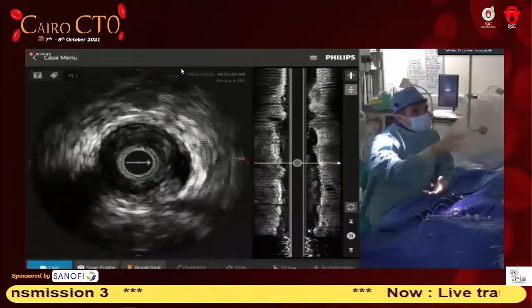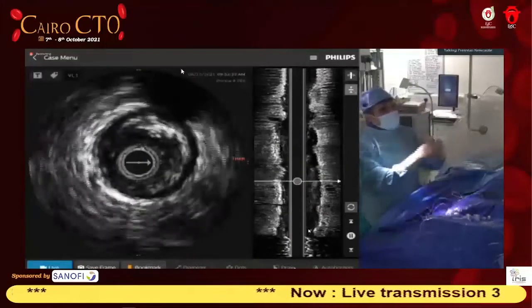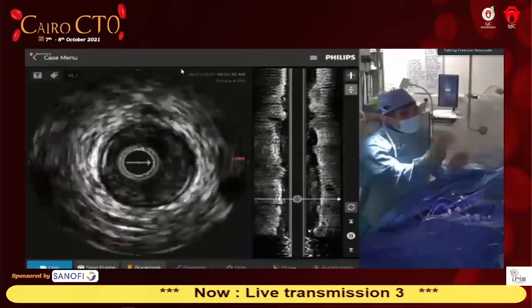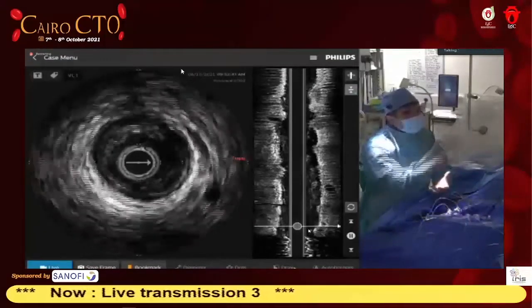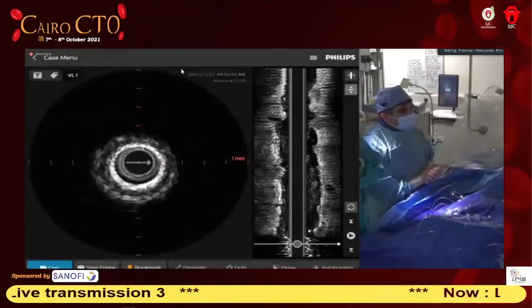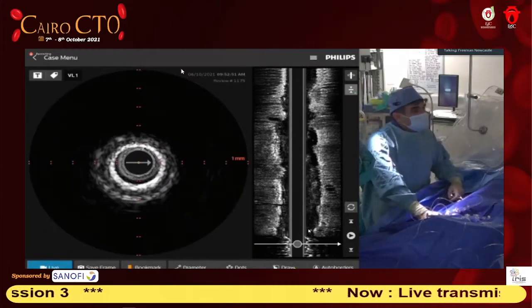And sometimes if there's no connection between the subintimal space and the true lumen, you put a stent in and it will baste it down. So sometimes treatment for this is a cutting balloon, just to cut the intima. I think in this case we will be okay. So I'm going to take a stent from the normal part of that, when it reconstitutes semi-normal, and we'll go back all the way. It's a very nice demonstration. Can I have a 3.0 by 33 Zions, please?